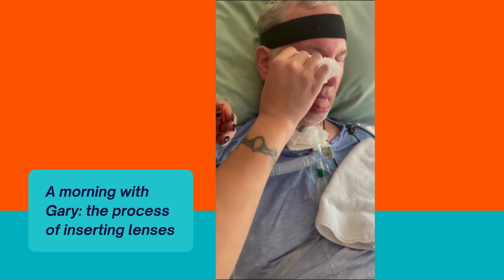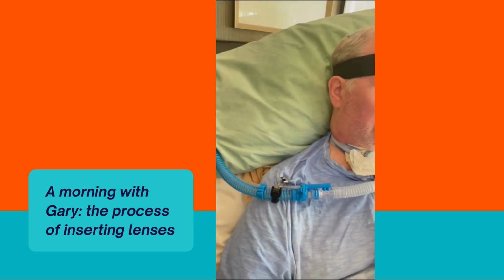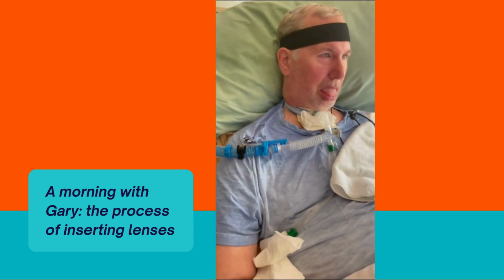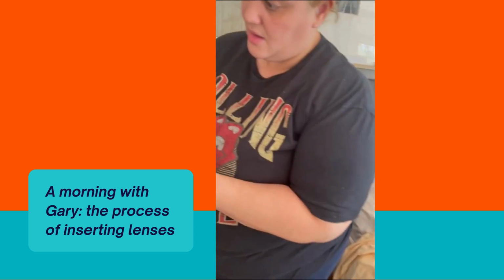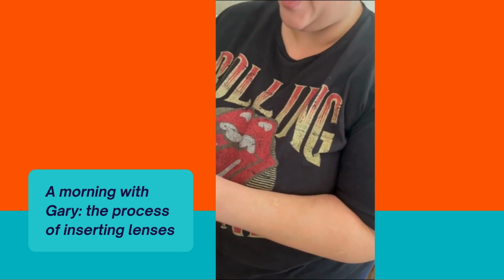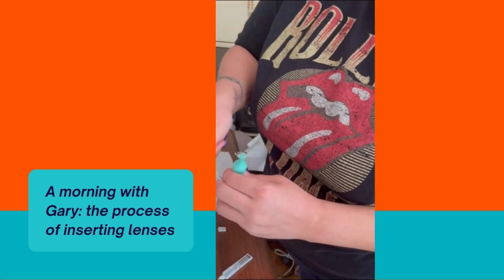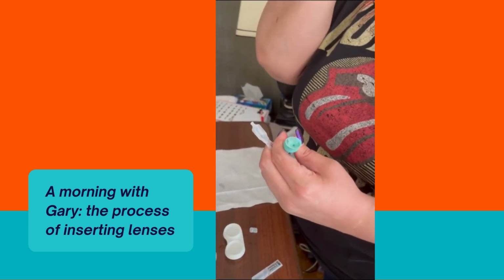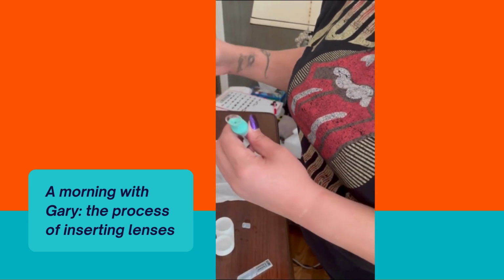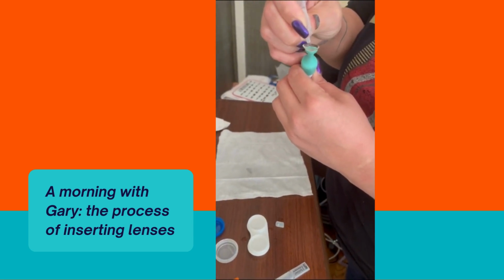That bubble you saw there makes it look more opaque than clear when the bubble happens. That was a big bubble. It's good, that was easy to see. Sometimes they're a little harder to see, especially if they're right on top of the pupil. I find them really hard to see when they're right on top of the pupil, and also if the bubble is the whole iris, then you don't see it at all. And he's like, bubble, and I'm like, Gary, there's no bubble. He's like, yes, bubble. So I just take it out when he says to, because you can't really tell.